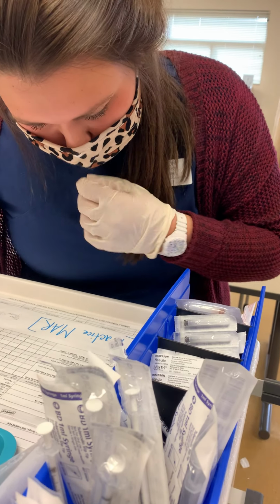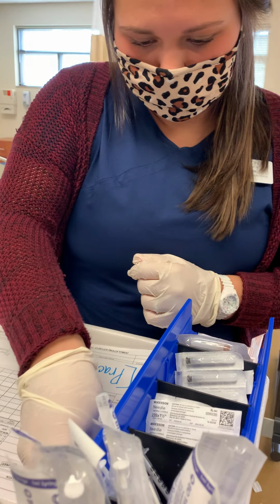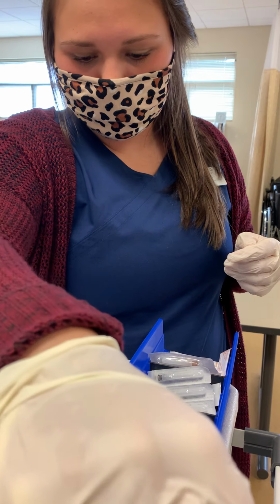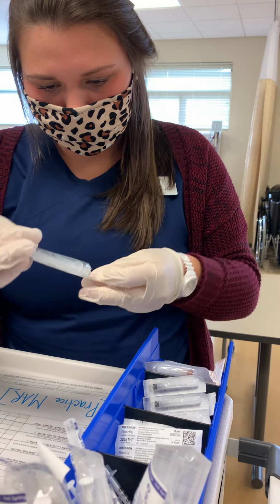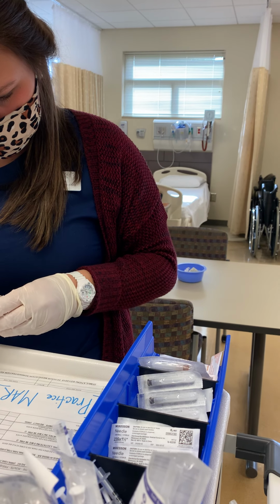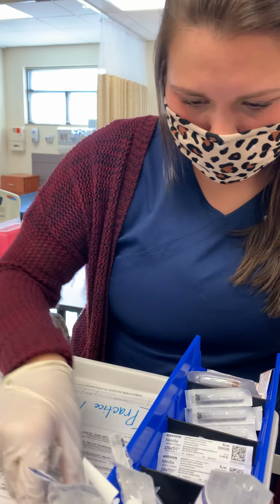So I have my hydromorphone HCl injection. I need 1 milligram. Okay, and I got my needle. It's going to be the gray needle.